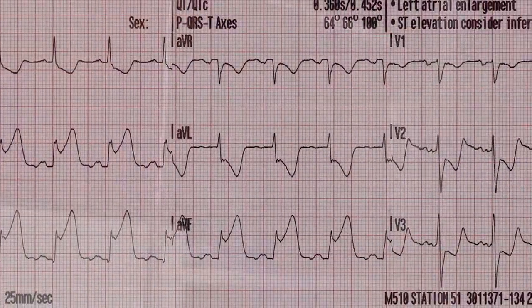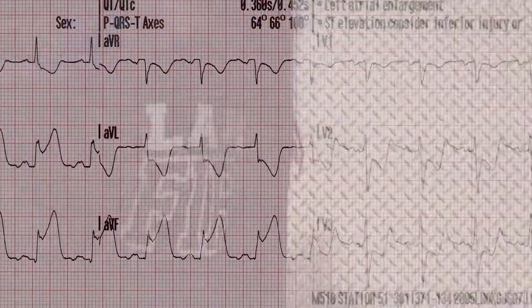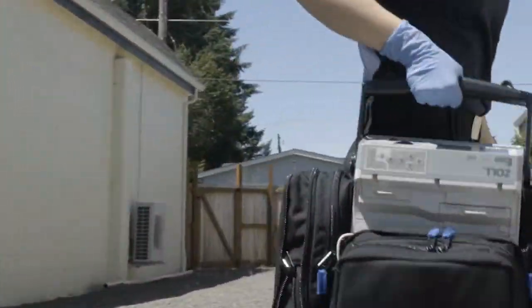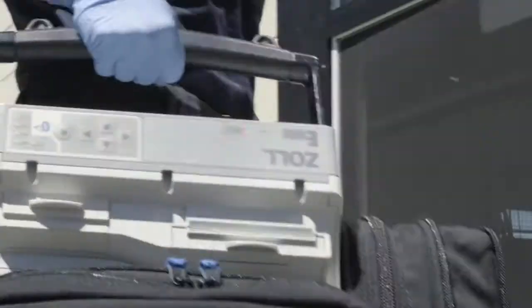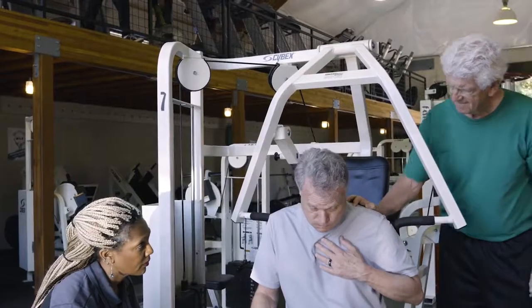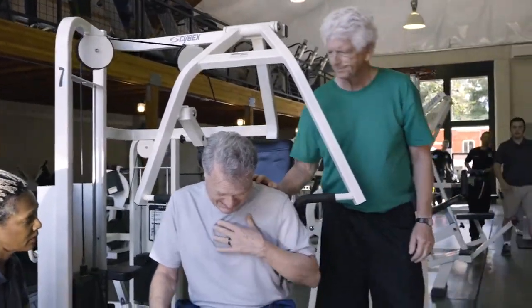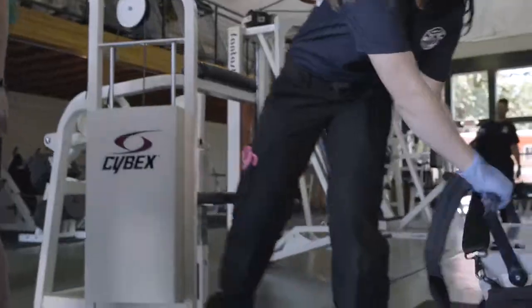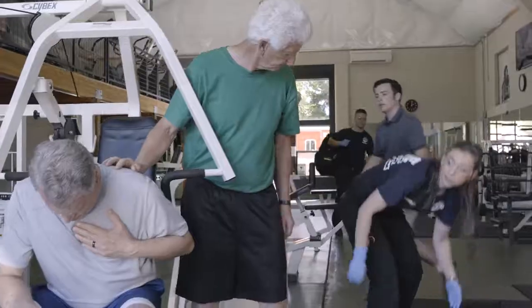A 12-lead electrocardiogram, ECG, is a graphical representation of the electrical activity of a person's heart. It produces a waveform that a qualified provider can interpret to determine whether a patient is STEMI or non-STEMI. In the past, 12-lead ECGs were only used by physicians to recognize AMI and to determine subsequent treatment decisions.